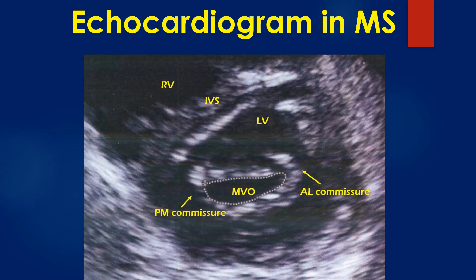The echocardiogram in mitral stenosis shows commissural fusion. The parasternal short axis view shows the mitral valve in cross section with the anterolateral and posteromedial commissures. The valve leaflets are thickened and the commissures are fused. The cut is slightly oblique, as a good cut should appear circular. It is often difficult to get a good circular outline of the mitral valve due to varying anatomical features of the chambers and cardiac position.